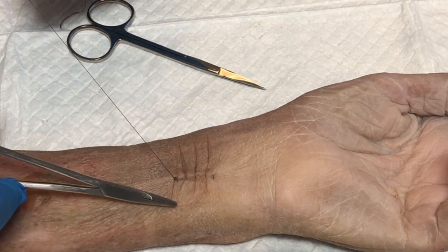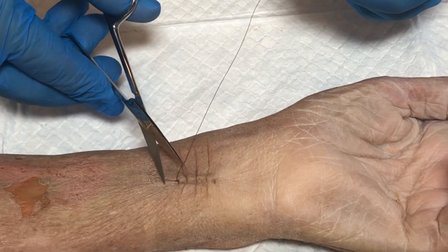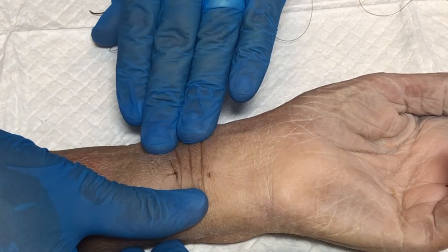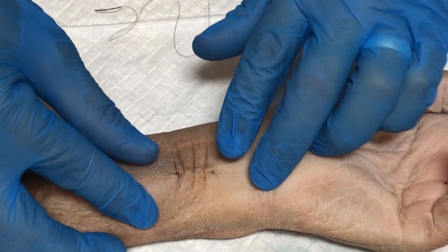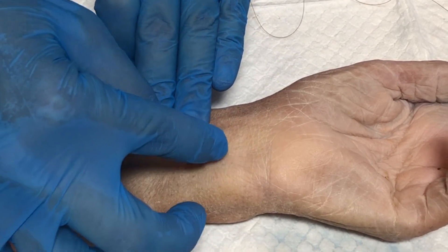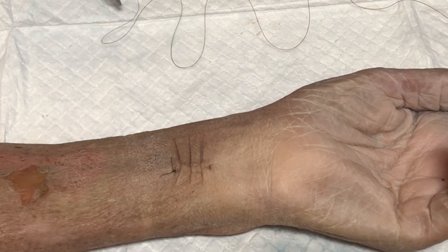Simply cut the thread and you have the re-approximation of the tissue utilizing this modified or extended horizontal mattress technique. We're going to do that one more time.